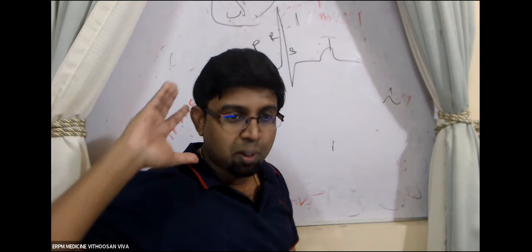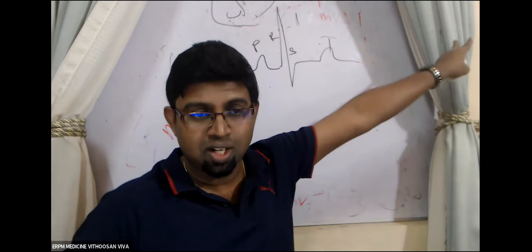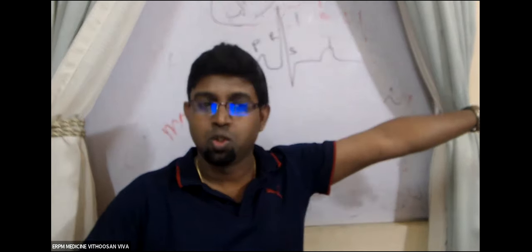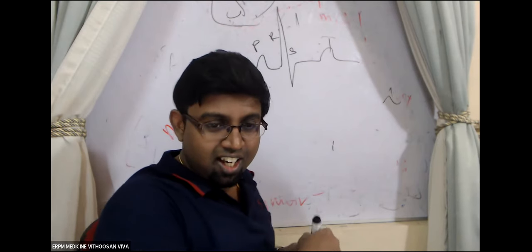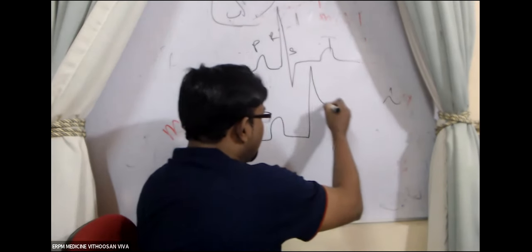So you are talking to him. He's connected to the cardiac monitor and you are talking to him. Suddenly something happens, so he develops an MI. Because of that, he develops a heart attack. Clear? So what heart attack has he developed?